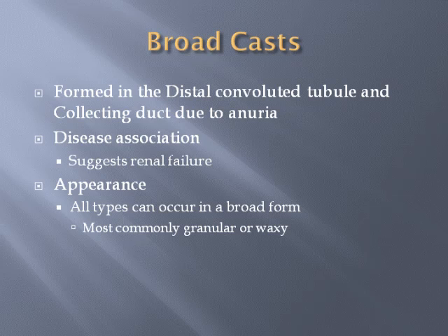If you see a very broad cast that is definitely cellular or anything like that, once again, get a supervisor and confirm, but most of the time they're waxy.